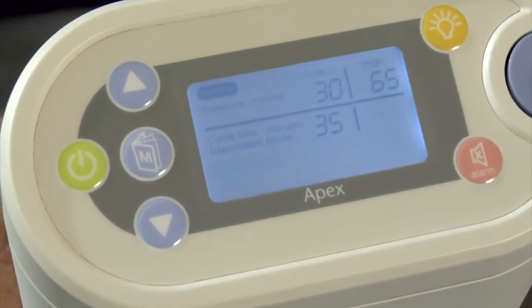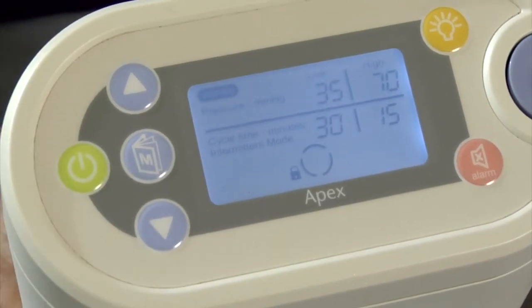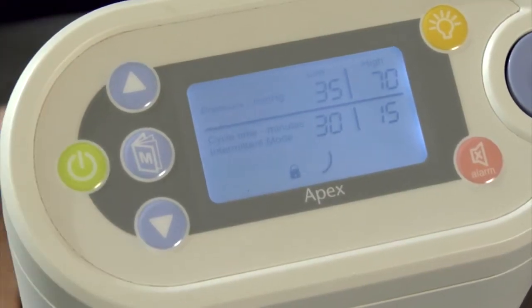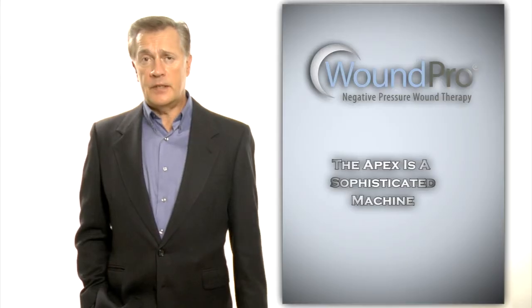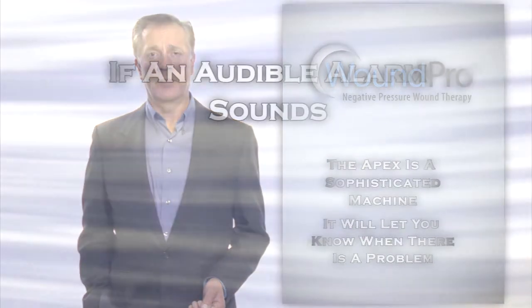To exit the programming menus, push the power button. Now the system is locked and on standby. To begin therapy and activate the system, press the green power button again, and you'll visually see the system activate with the circle rotating. The Apex is a sophisticated system and will let you know if there's a problem.